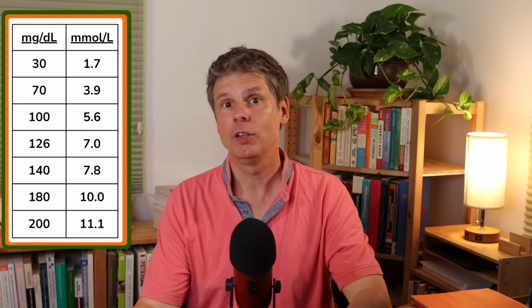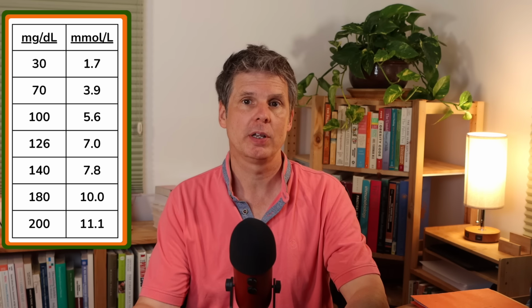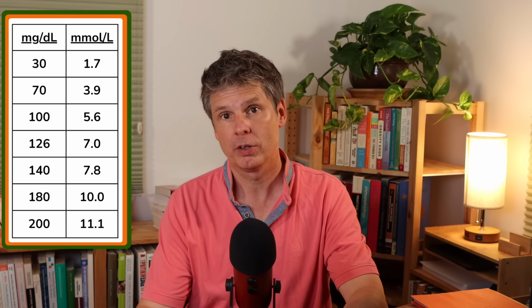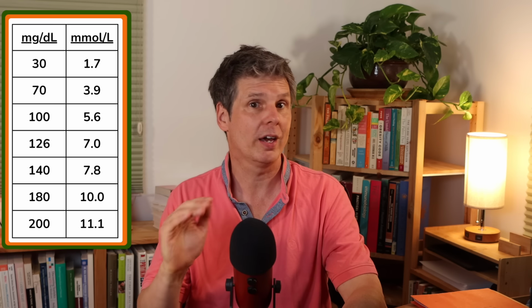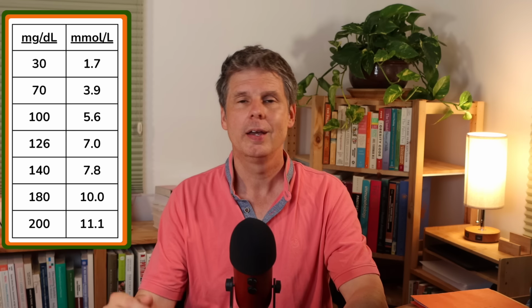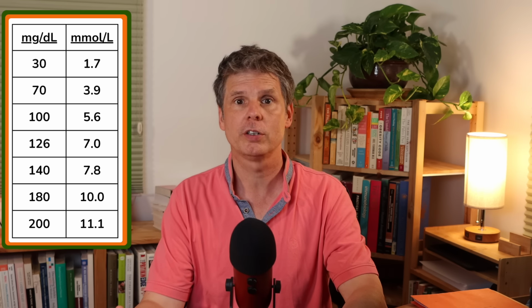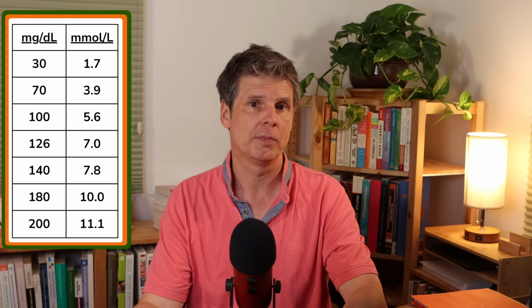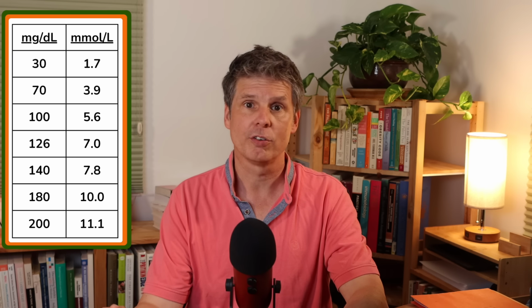In summary, taking these considerations together, I conclude that any increase to 180 milligrams per deciliter or higher is probably a first sign of mild glucose intolerance, because it doesn't normally occur in the most glucose-tolerant populations ever, no matter what they eat. And such an increase to 180 milligrams per deciliter or higher is probably associated with an increased risk of several chronic diseases, at least if it occurs regularly. That's why I define an increase to 180 milligrams per deciliter as a spike that we want to avoid.